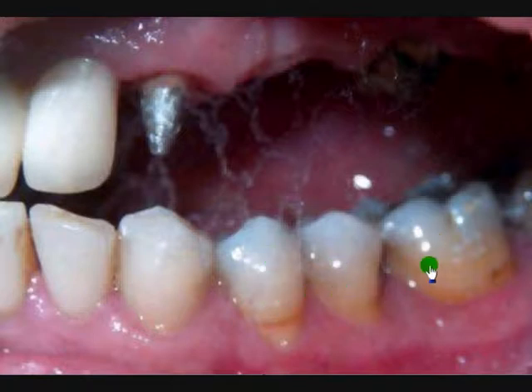But the mapping is necessary anyway, because even if the shade will be lighter, applying a difference of chroma intensity in the body, or different values over the enamels of these units, will anyway come out with a more three-dimensional and a more natural tooth, compared to just going in with some simple two-layer porcelain buildup.